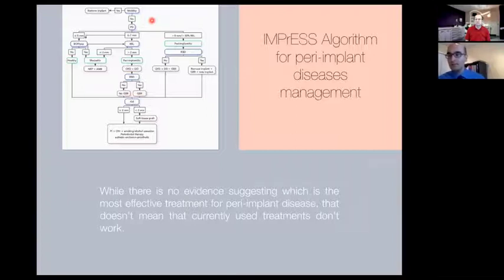You may decide to apically position your flap, exposing more of your implant surface at the expense of compromising aesthetics, which is manageable in the posterior area, but you will have healthy probing depth around your implants and make sure there are no reservoirs for bacteria. Or if you see the defect is amenable to regeneration, you can consider regenerative therapy during this procedure. I'm very focused on keratinized attached gingiva because in my own practice, I see more problematic implants with inadequate keratinized attached gingiva. If that's not sufficient, we will produce it around the implants before or after the peri-implant surgery, depending on how you manage your protocol.